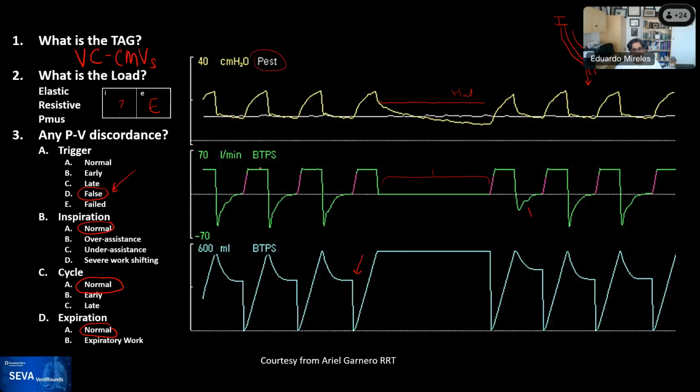The first option is to change from a flow trigger to a pressure trigger. That may sometimes work, although the patient is going to sometimes have to generate a large amount of effort in the setting of that leak. Another one is to change to a mode that uses a non-airway signal like NAVA to trigger the ventilator. The other is to essentially recognize that there's always going to be a leak triggering this, and change the patient to a mode where triggering is irrelevant.